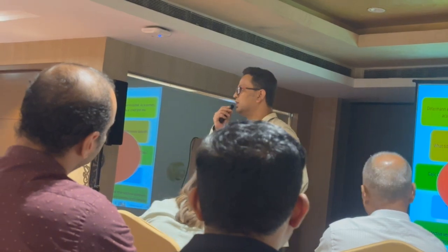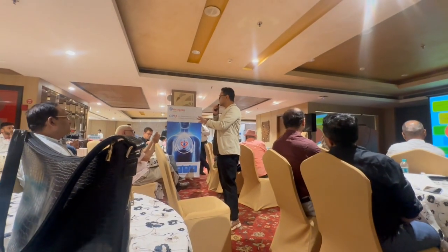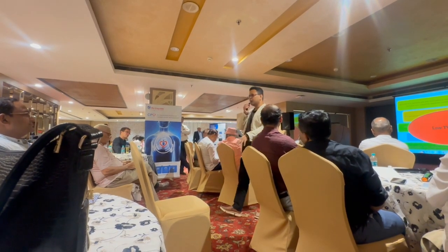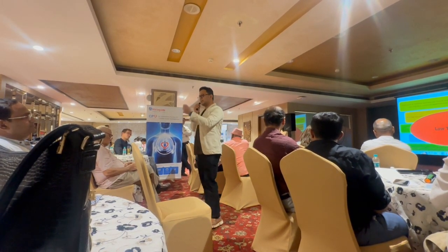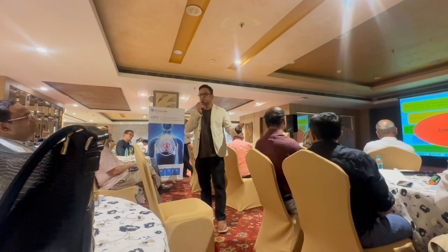No, when we are sitting and discussing over a tea, coffee or a drink, everybody speaks 6 ml, 8 ml. But the funny part is that if you see the evidence, less than 30% of the people worldwide are actually using low tidal volume. Now this is from evidence-based medicine. Less than 30%. I'm not talking about this country, I'm talking about both continents. So despite understanding that low tidal volume is mandatory for patients being initiated on mechanical ventilation, still there is no adherence to this policy.